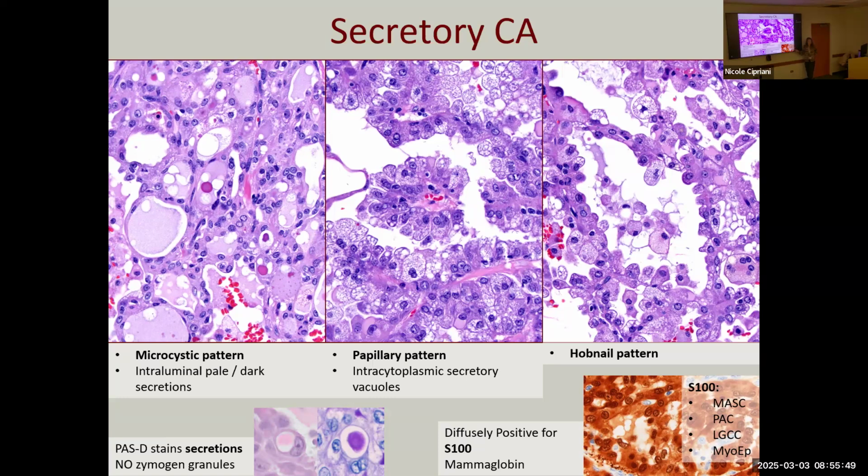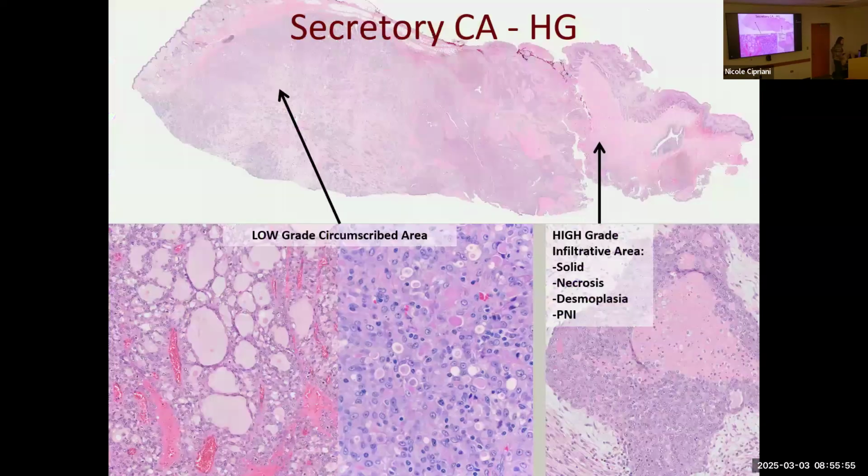A myoepithelial carcinoma can be strongly S100 positive, right? And then there's this other intraductal carcinoma that we'll talk about in a minute. So there are charts at the end of this lecture going through this immunophenotype, so just hold for that. Just like I sound like a broken record, just like any other salivary gland tumor, this can undergo high-grade transformation, necrosis, mitoses, etc.